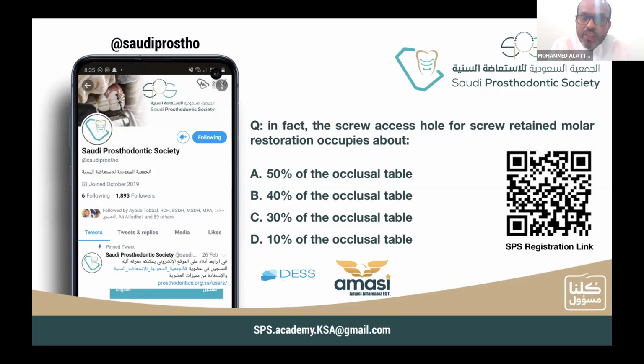When the clinician has the abutments, he can fabricate this instead of doing it by wax; he can do it by Duralay. You can bring it to the clinic, insert it in the patient's mouth, and see the relation. If you have the silicone index from the diagnostic wax-up or the provisional, you can see the thickness. Now I have the thickness of the metal from the Duralay, and the thickness from the abutment, for the porcelain that I need to place.